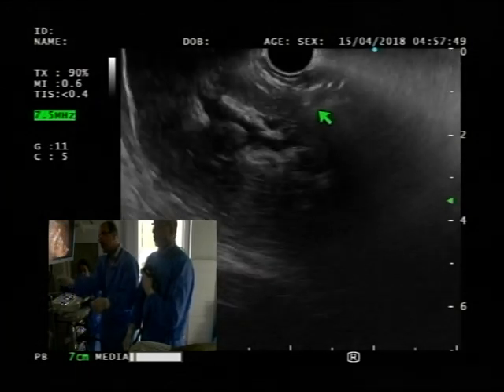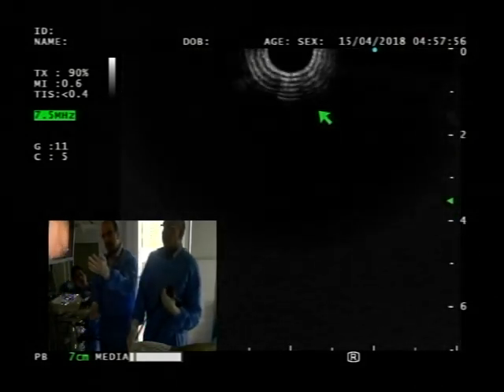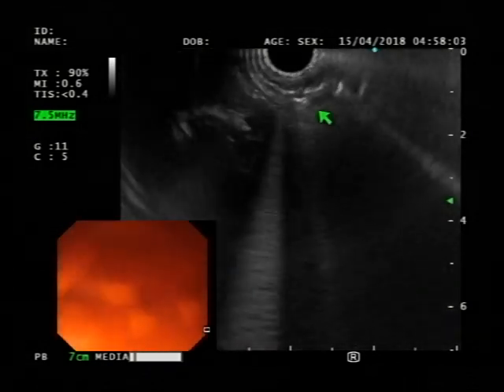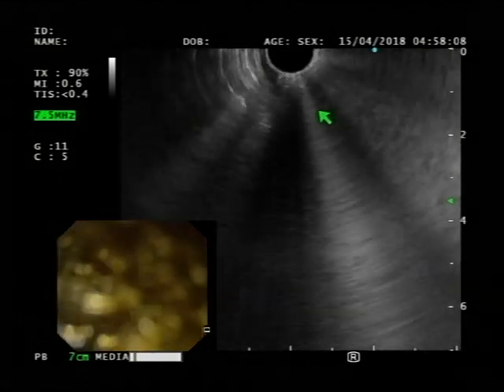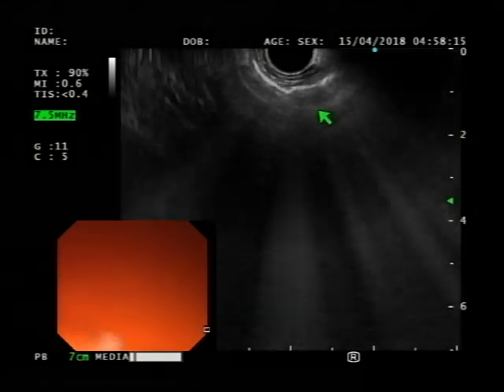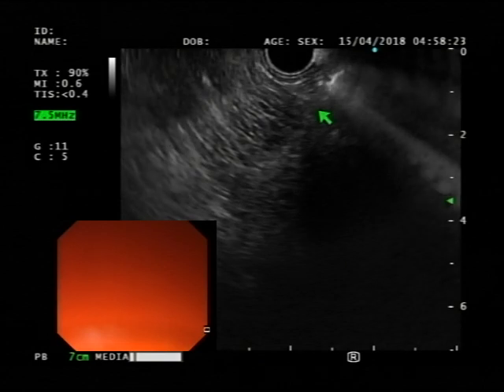So you'll start to see the liver, and as you pull back, you start spinning left and right, and eventually you will get suction because you need to keep it completely decompressed. Turn into the back wall, and now as you pull back and go counter and clockwise, that'll show you the pancreas. So that's liver. So maybe we need to go more clockwise because liver is higher up.